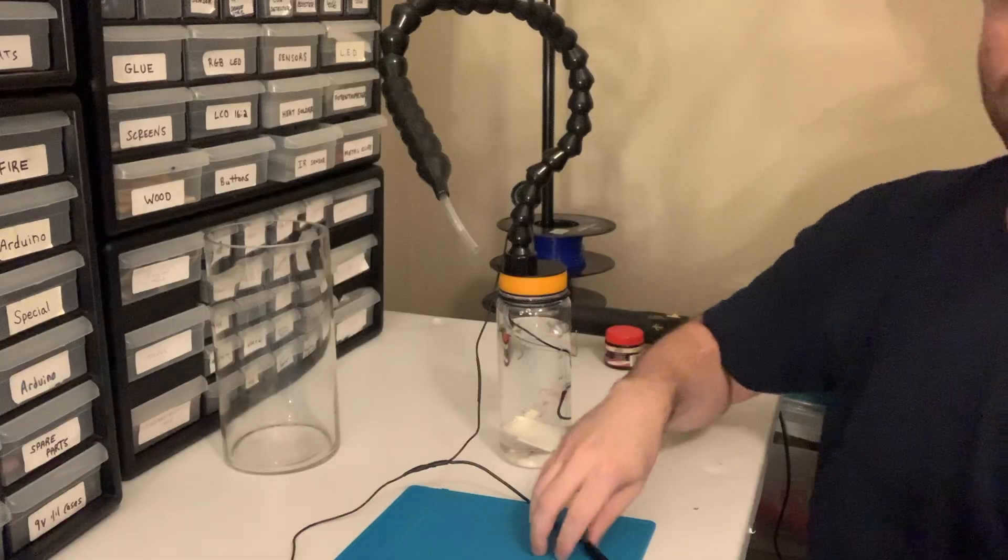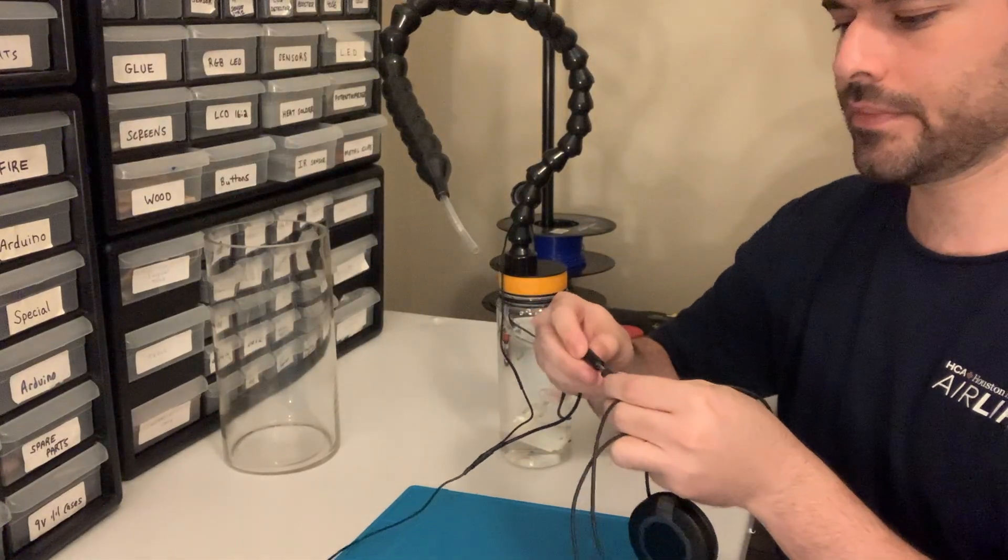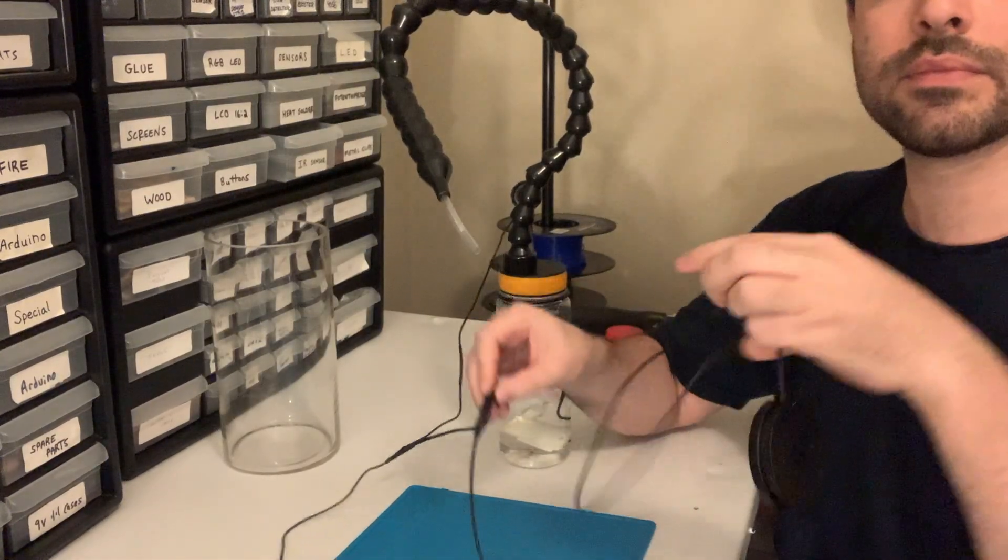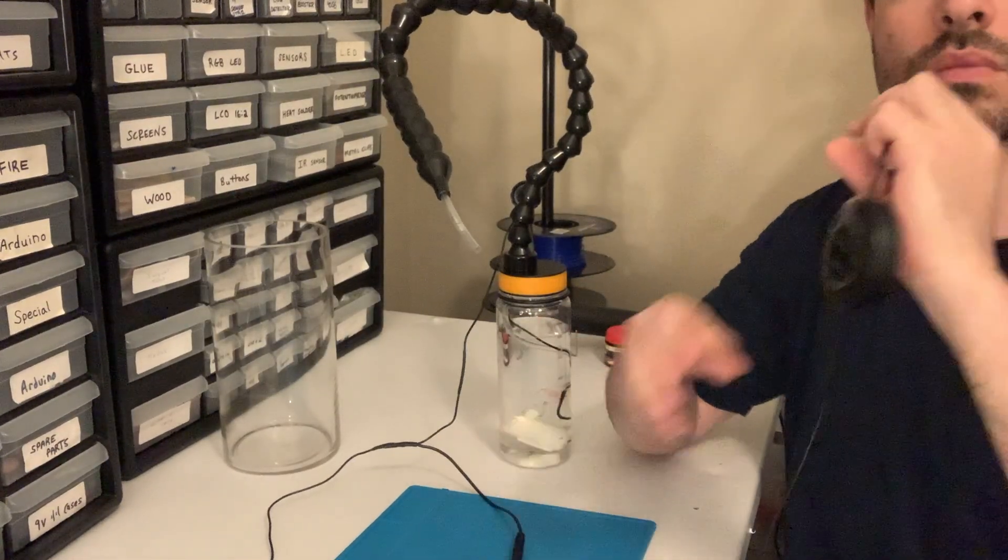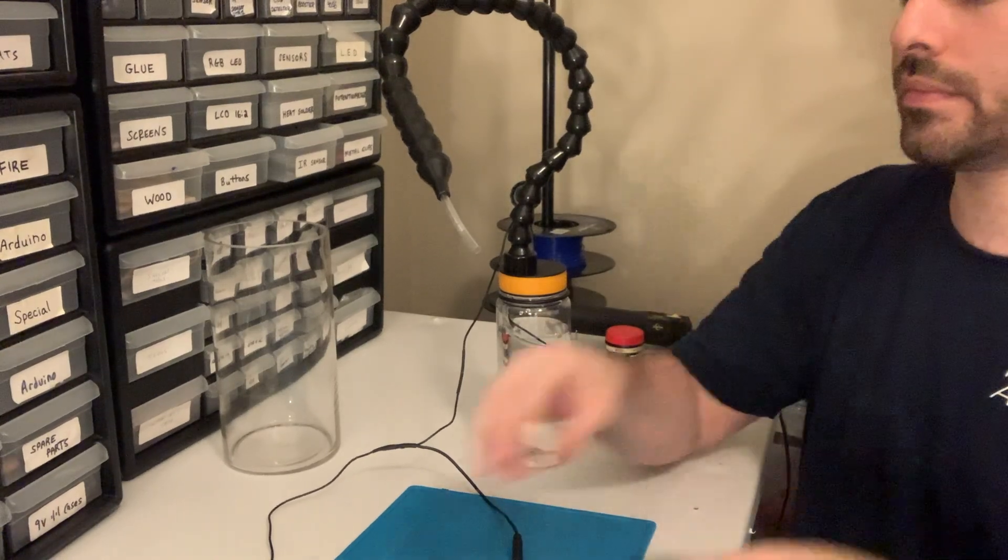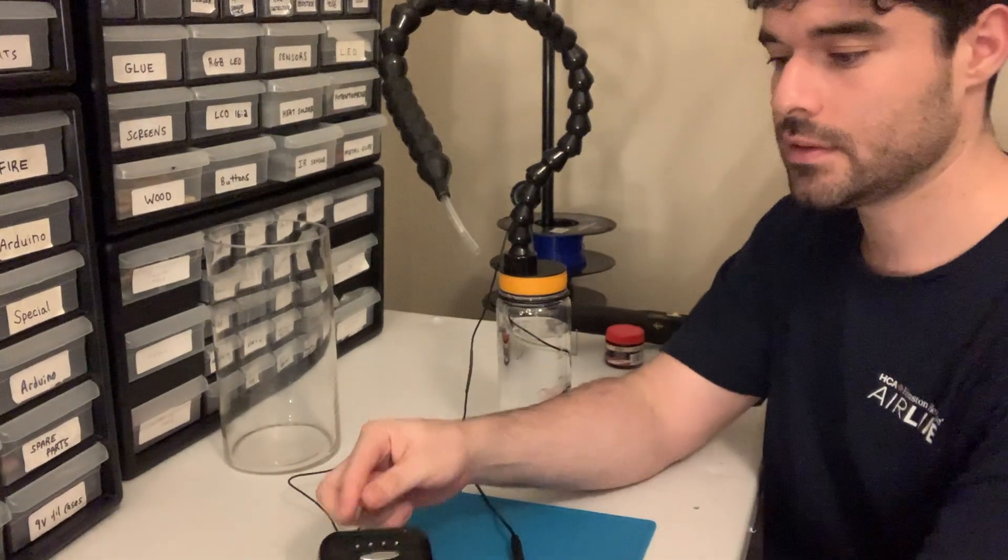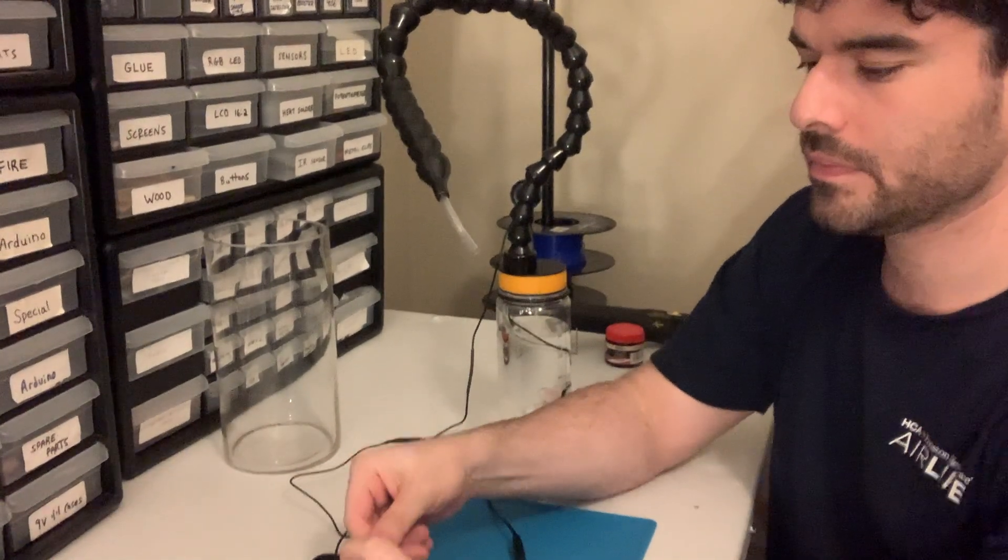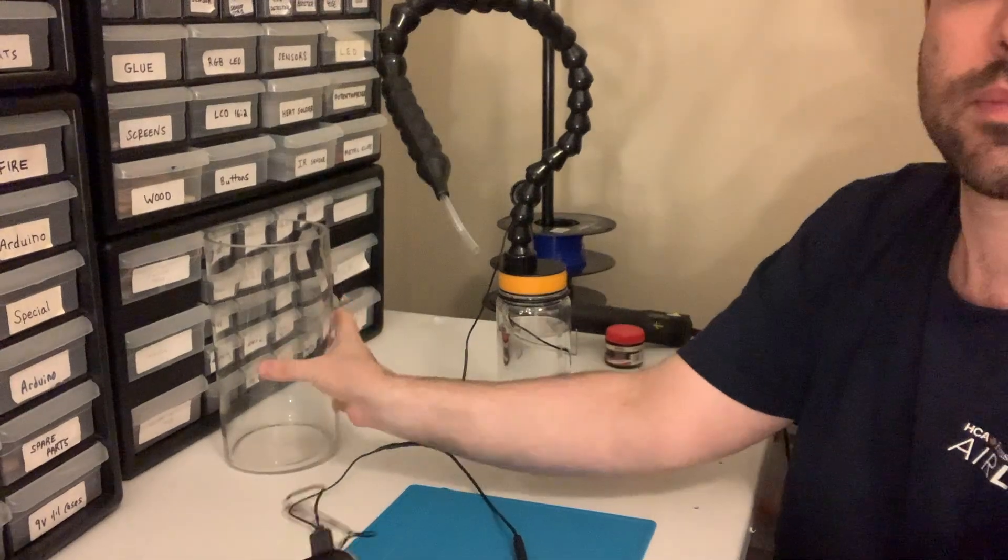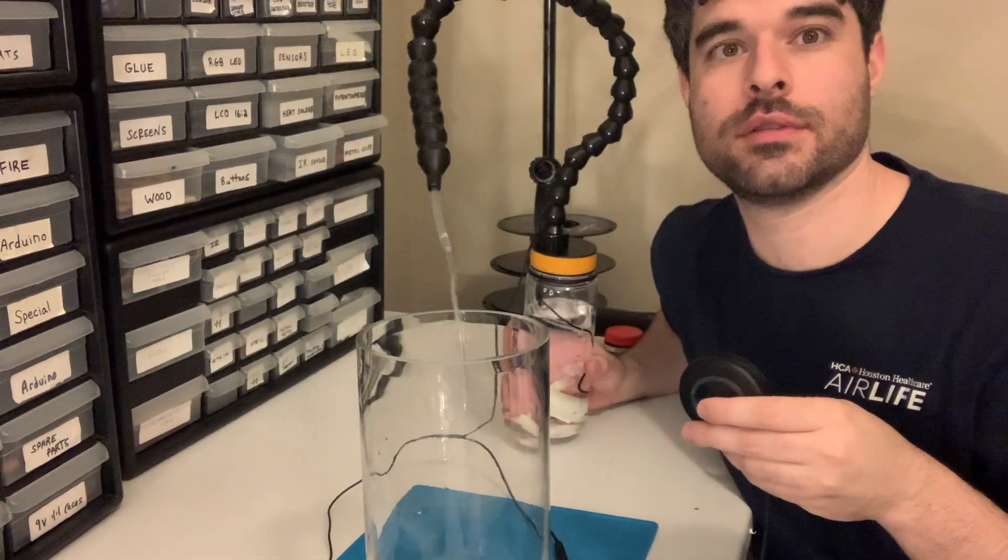We're finally ready to test out the system. I'll plug in a switch adapted button into the mono cable, and the USB is going to plug into this power supply over here. As you can see, every time I push the button it should give us a little bit of water.